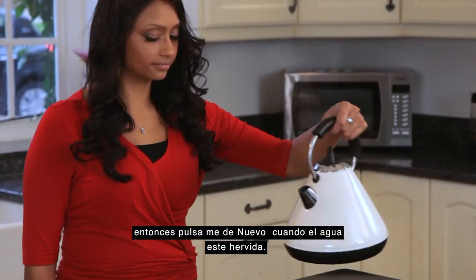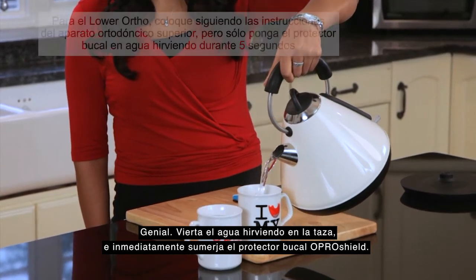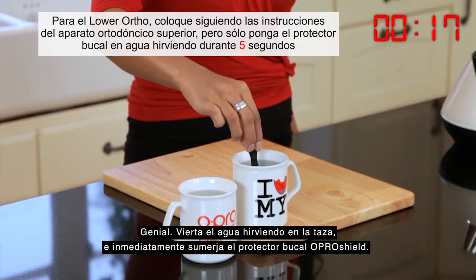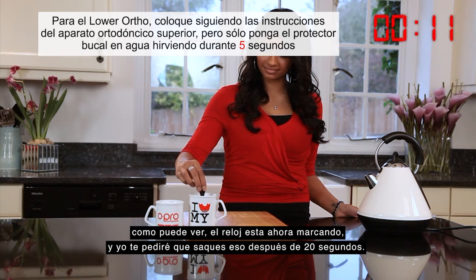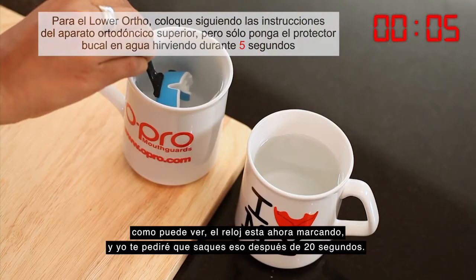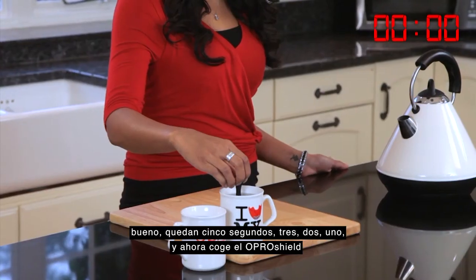Great. Pour the boiling water into the cup, and immediately submerge the OproShield mouthguard. As you can see, the clock is now ticking, and I shall ask you to take it out after 20 seconds. Okay, five seconds to go. Three, two, one, and now.